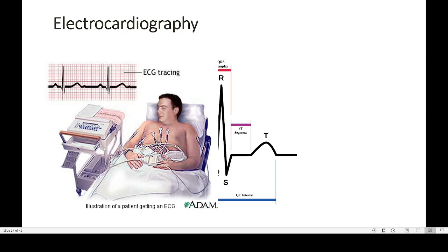The QRS, okay? That means the QRS is normally produced when the ventricle is contracted. So if the height of the QRS is smaller or shorter, it means the ventricle is not having a proper, complete contraction. This way the doctor will be able to get some idea about the working of the heart.